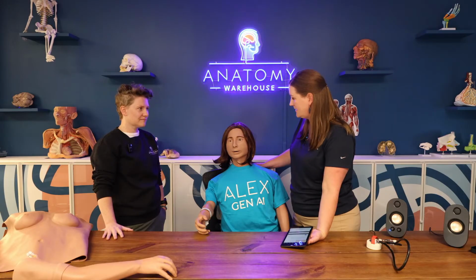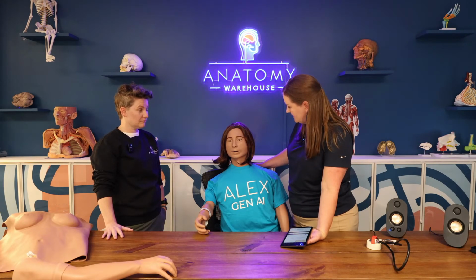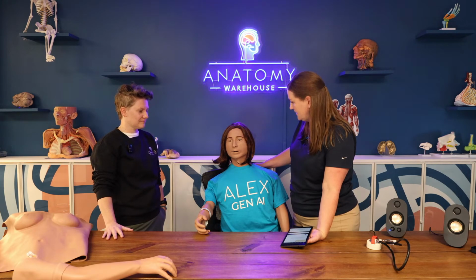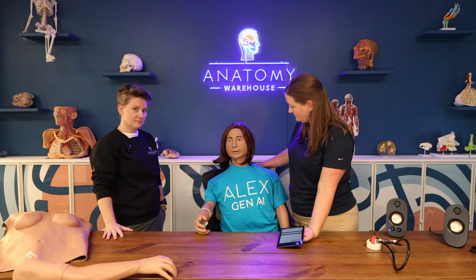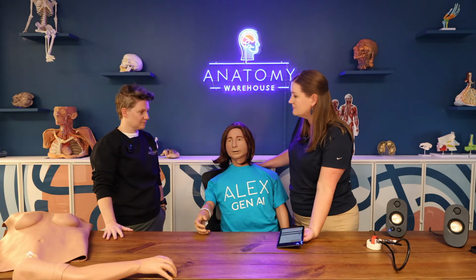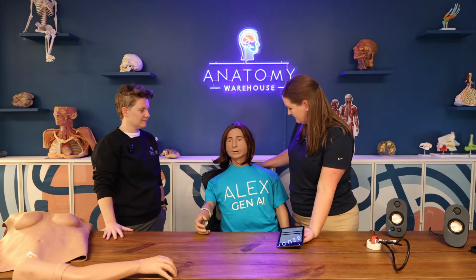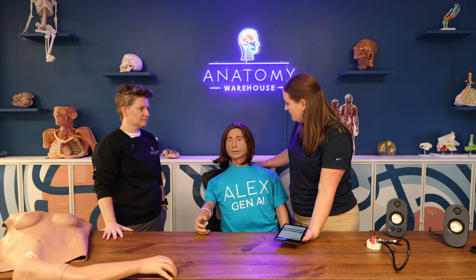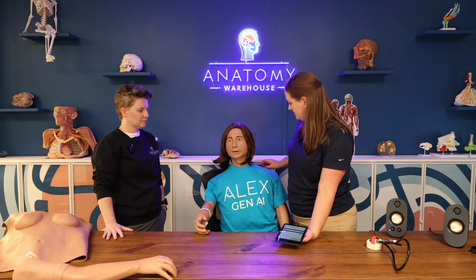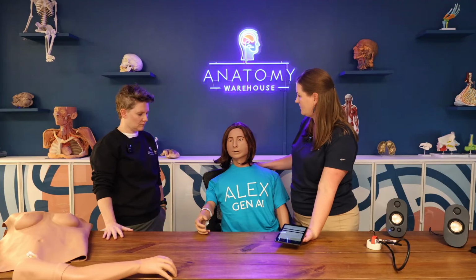Okay, that makes sense. Vivian, are you sexually active? Yes, I am. And are you using any kind of contraception? I take birth control pills. Okay, and do those seem to be working well for you? Yes, they are. I've been taking them for 10 years. Okay, great. Vivian, how old are you? I'm 24 years old.